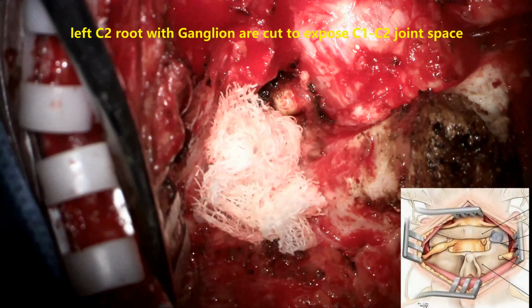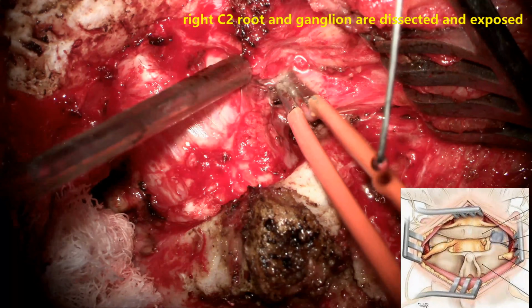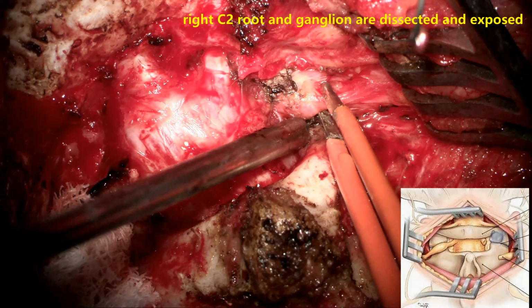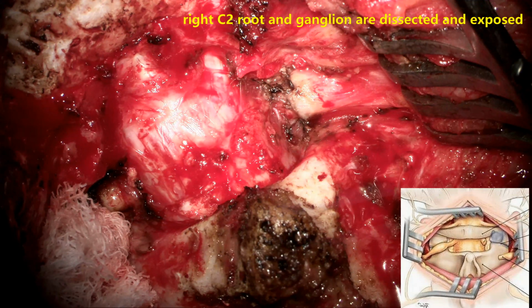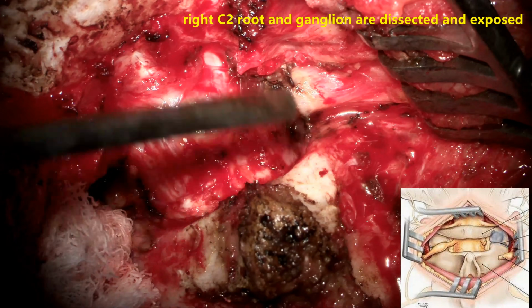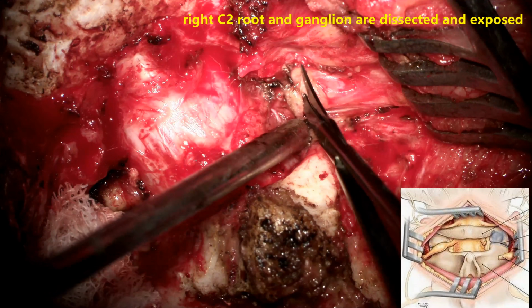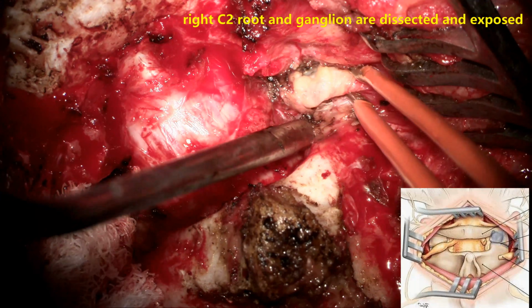Once we achieve this, we close this side and go to the right side. A similar procedure is conducted on the right side. The C2 nerve root is exposed and carried distally, and the extradural venous plexus is coagulated, and the C2 nerve root along with the ganglion is dissected, cut, and separated.